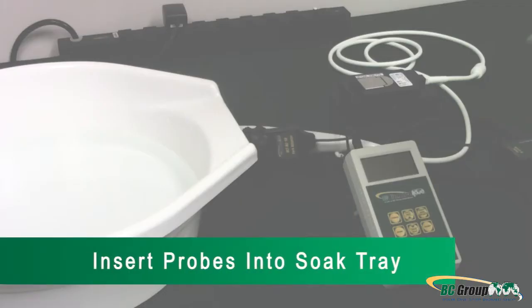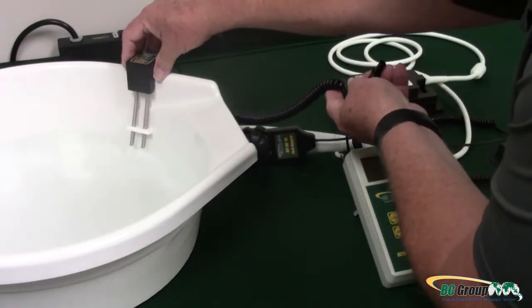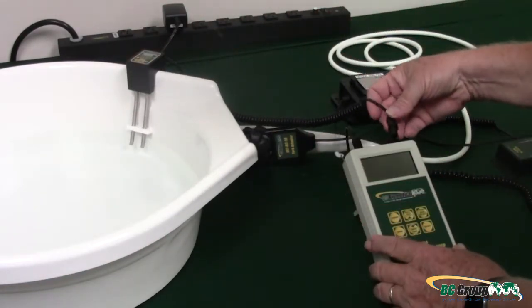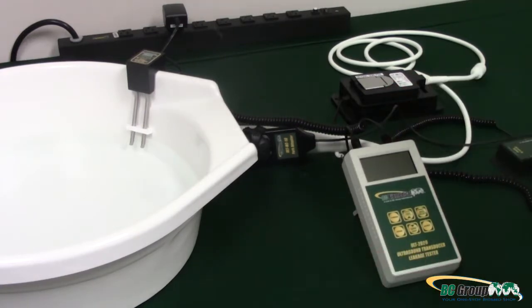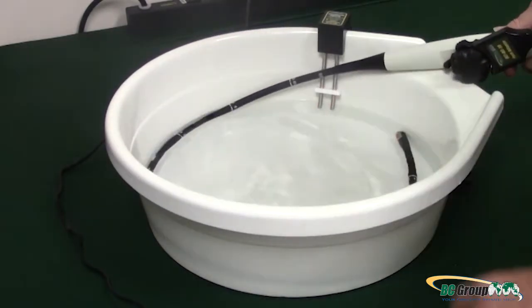Step 3: Insert Probes into the Soak Tray. Start by placing your Dual Prong Conductivity Probe on the edge of the Soak Tray, ensuring the tips are fully inserted into the cleaning solution. Next, place your Ultrasound Probe into the Soak Tray.